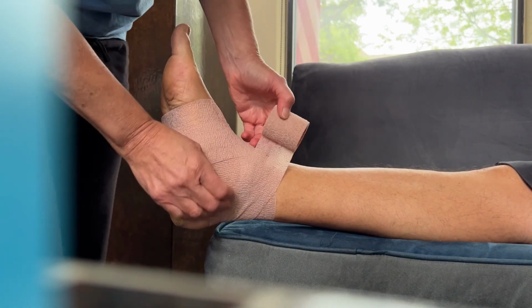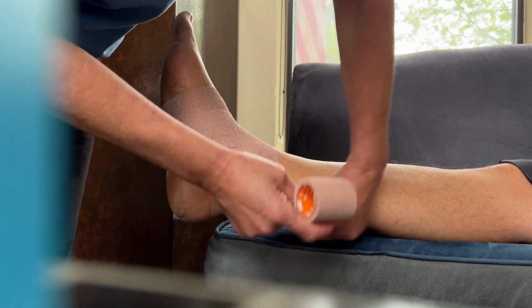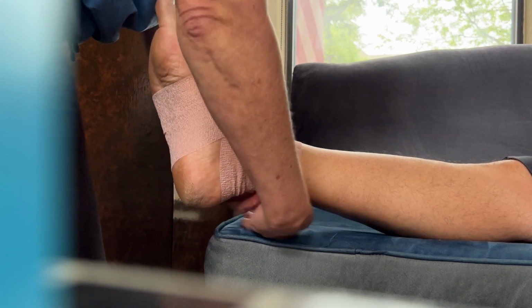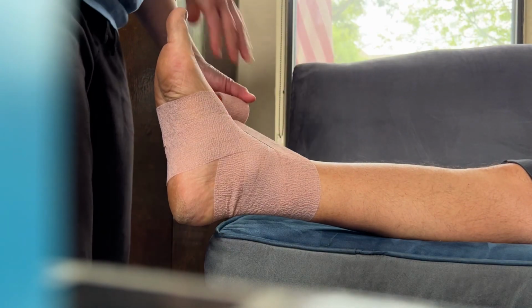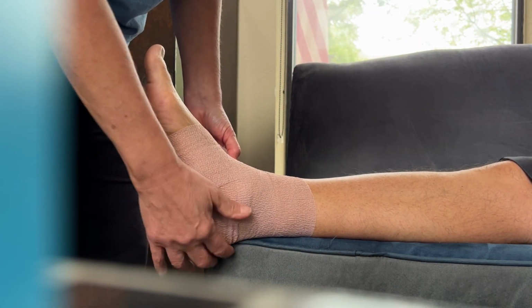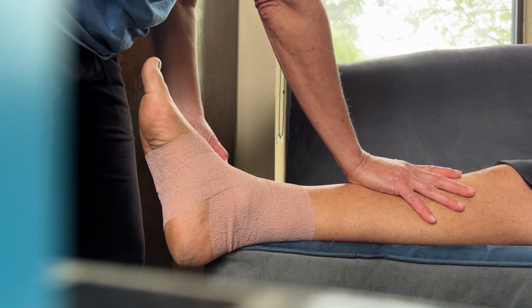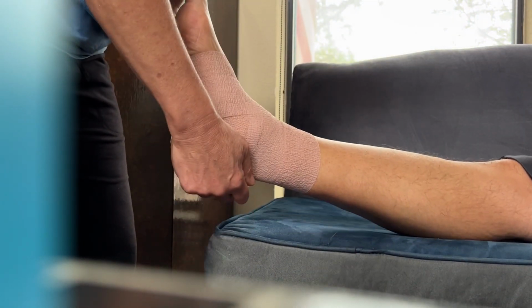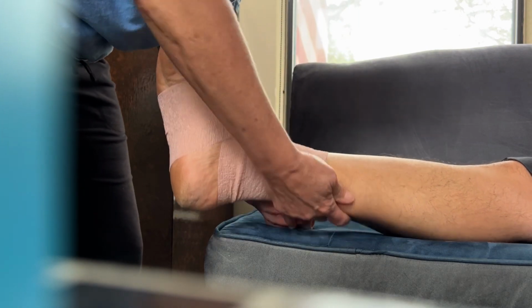I make sure that there are no wrinkles, because wrinkles can cause pressure, and we don't want any bad pressure. If you're working with somebody who has diabetes or decreased sensitivity, any crease can cause a problem. My friend does not have either. He has full sensation. This guy has full sensation. So we're not going to have a problem with this. So I keep going up and down.